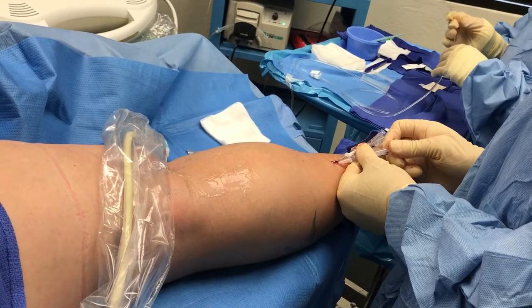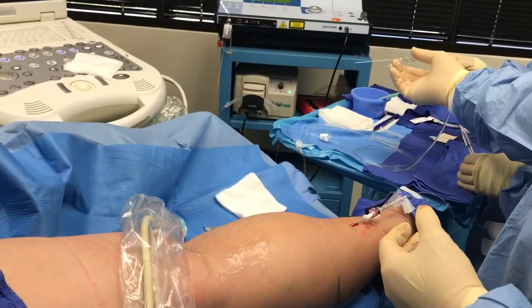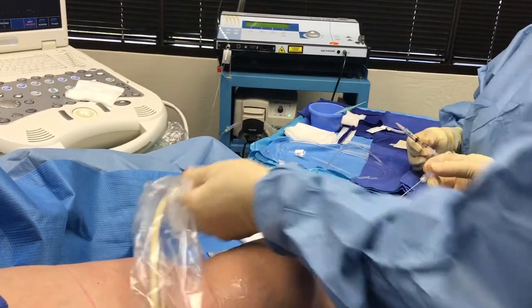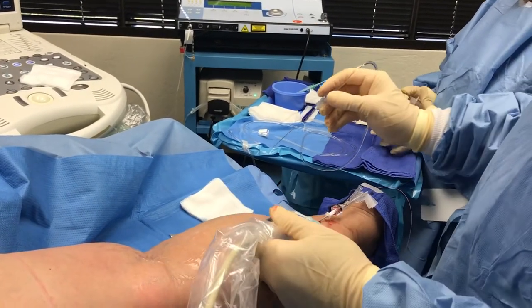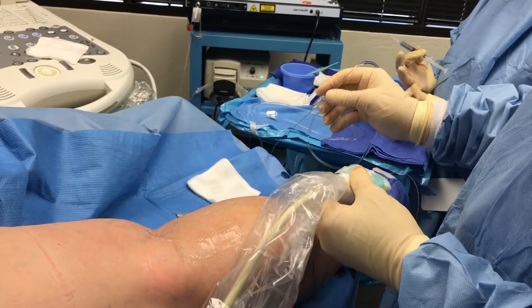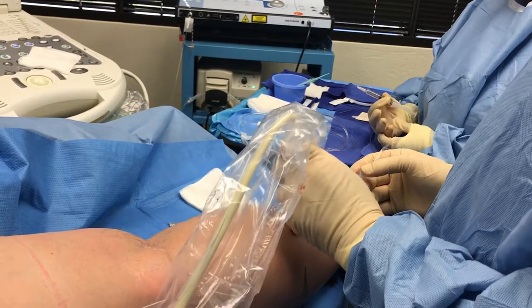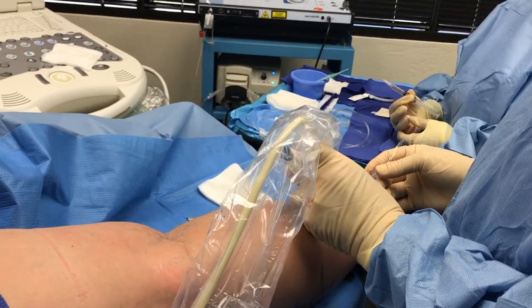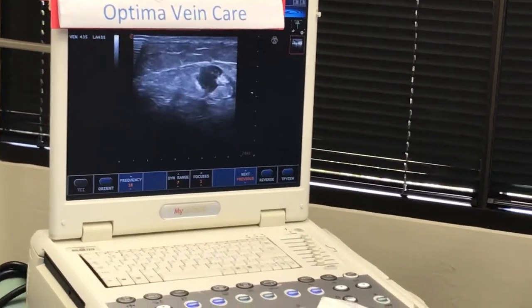You can do that with what's called tumescent anesthesia. There's a Klein pump over there. It's important before you put this in to blow any bubbles out, because if you put bubbles underneath the skin it interferes with your image quality. You'll feel a little bit of stretching inside your leg as we put this anesthesia in for you.